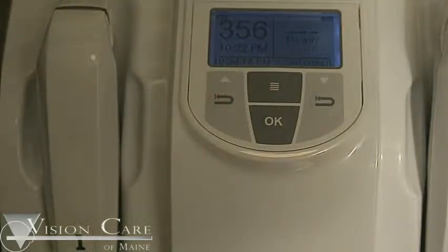Now what Mary has done is taken a sample of your tear, placed it into the tear lab measuring device, and this device is really unique because in minutes it can tell us what the concentration of your tear is. And we see in looking at the machine that the concentration measures 356 milliosmoles. That is very high. The fact that it is as high as it is means that you have severe dry eye, and that explains the symptoms that you're having. And without going further, we know that we need to address that dry eye with different kinds of tears than ones that you may have been using.